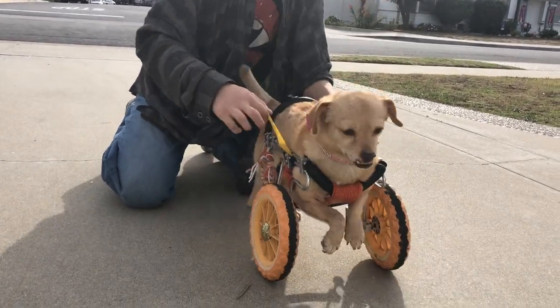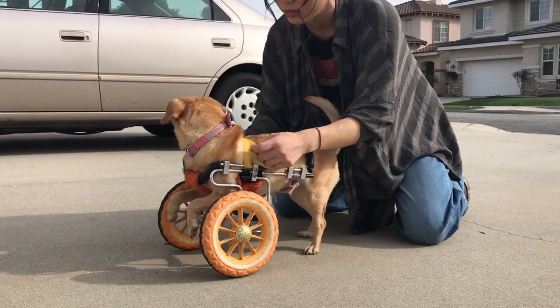I go ahead and proceed to putting her front legs inside. The last step is putting the back straps on, and then that's it.